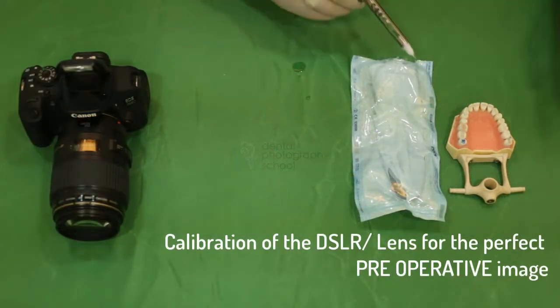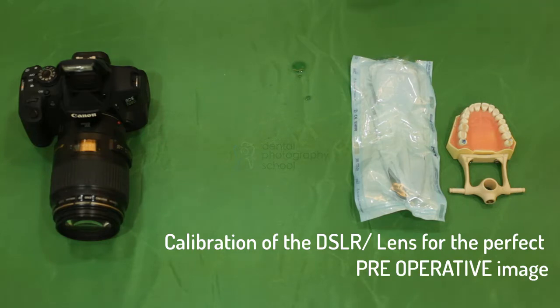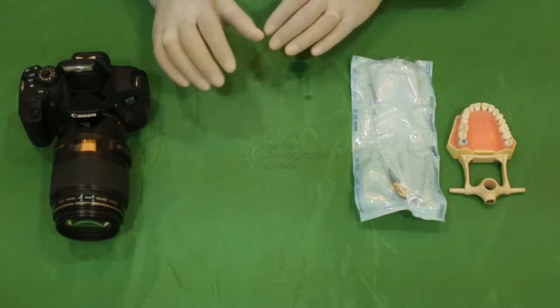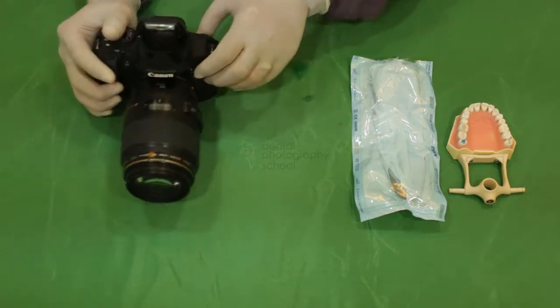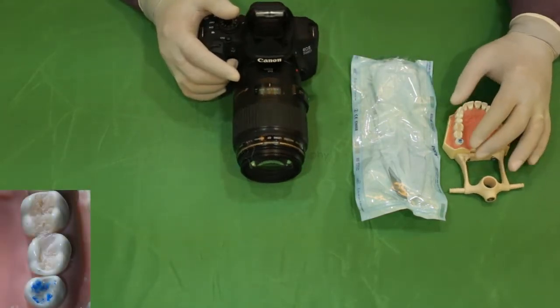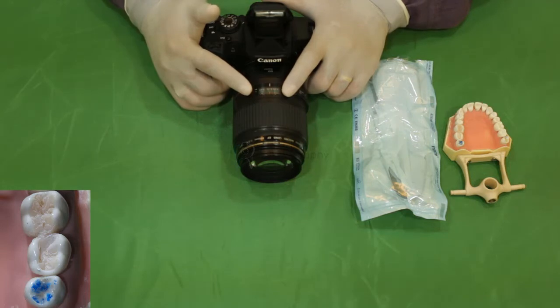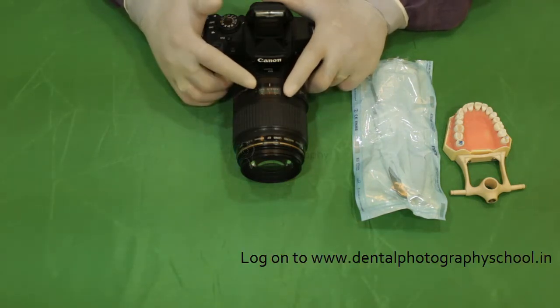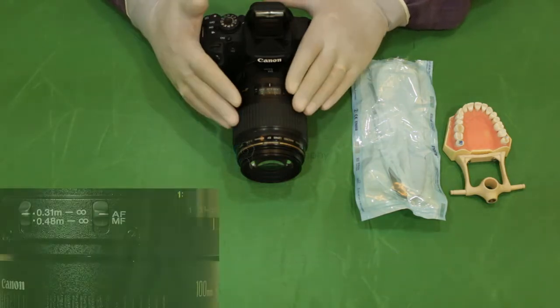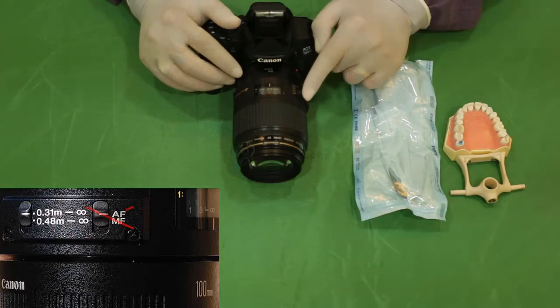We begin with administration of anesthesia. We usually wait 5–10 minutes after administration of local anesthesia for it to act. It is at this point that we will be setting our DSLR and macro lens for the image. I will be recording only a quadrant of the maxillary arch, so I have set my magnification ratio at 1:2. Before setting your magnification ratio using the focusing ring, please make sure that your lens is on manual focus (MF) and not on AF.